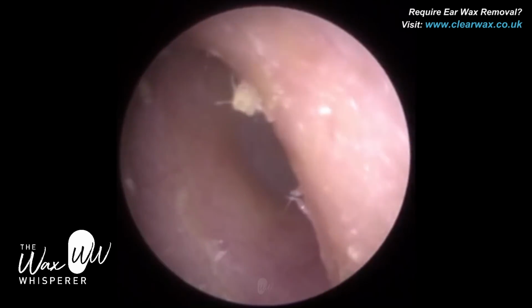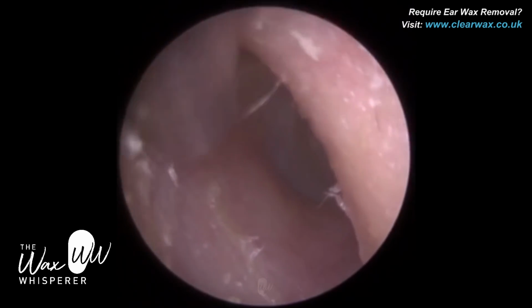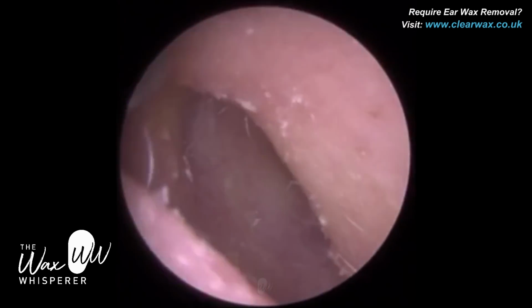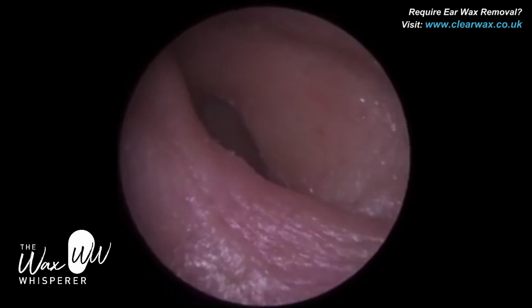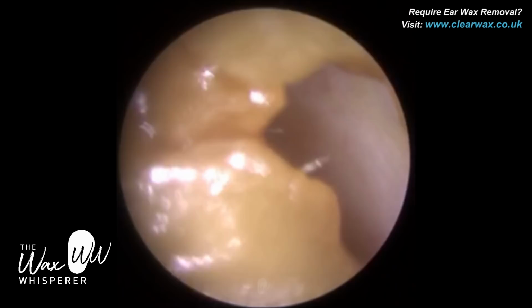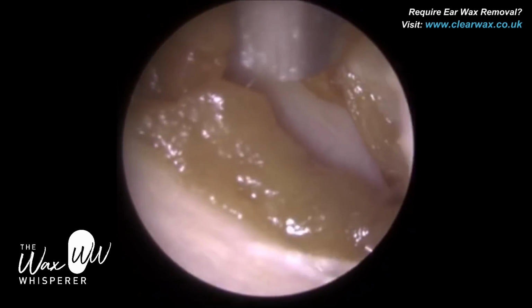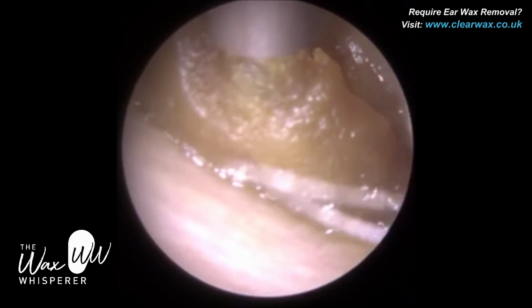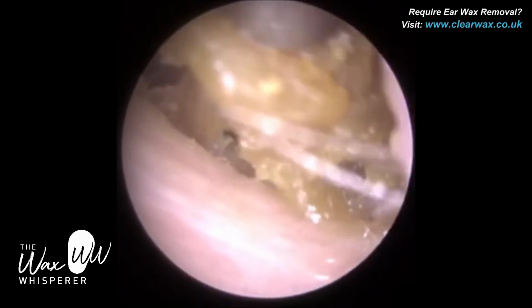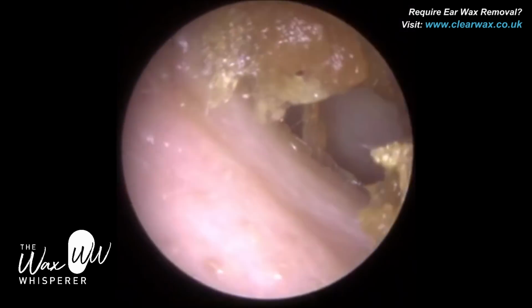Another occasion where I tend to remove dead skin that's lining the ear canal is when it's infected. Otherwise, generally speaking, you can leave this dead skin, or someone's got a cavity in the ear canal, so either a crater at the base of the ear canal or a mastoid cavity where the mastoid bone on the posterior part of the ear canal has been drilled out due to an infection. Because skin dies and sheds from the eardrum outwards towards the entrance of the ear, and if you've got a cave or a crater or a cavity, this skin can collect and then get infected. So that's another occasion, a clinical need, where I remove the skin.